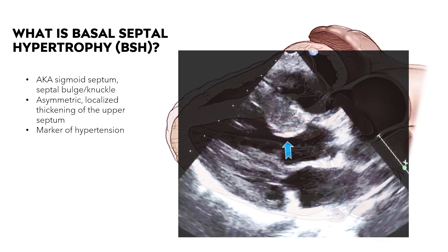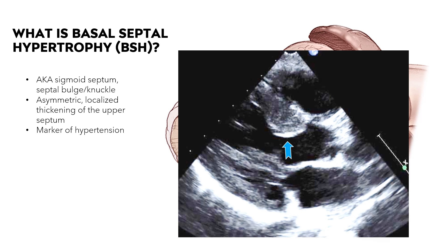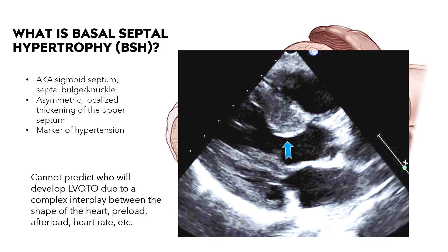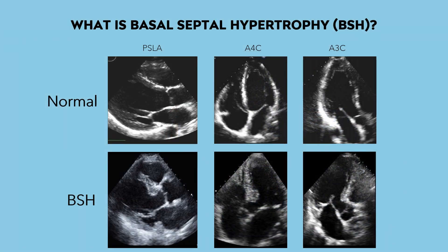Here's the appearance of basal septal hypertrophy on echo. It has been associated with exertional LVOT obstruction and unexplained exertional dyspnea that responds to beta blockers. However, trying to predict who will develop an LVOTO is largely unpredictable due to the complex interplay between the shape of the heart, preload, afterload, heart rate, and many other factors. Examples of basal septal hypertrophy are shown in the parasternal long axis view, apical 4-chamber, and apical 3-chamber — the septal bulge is most prominent in the parasternal long axis view.